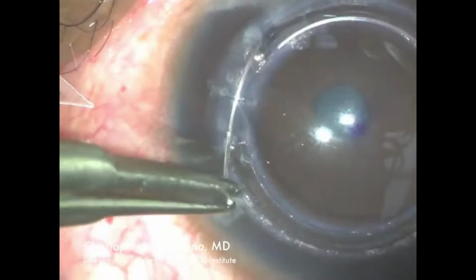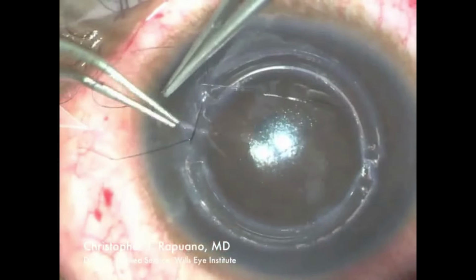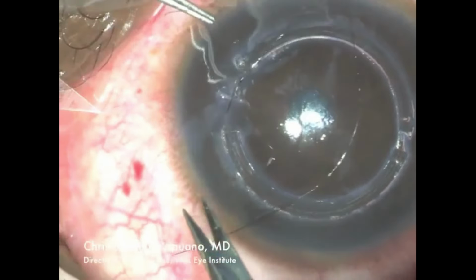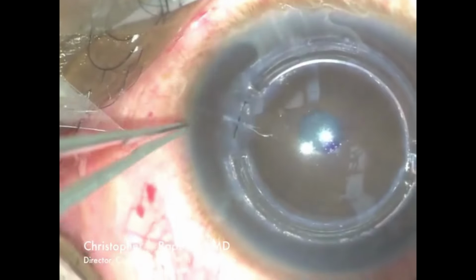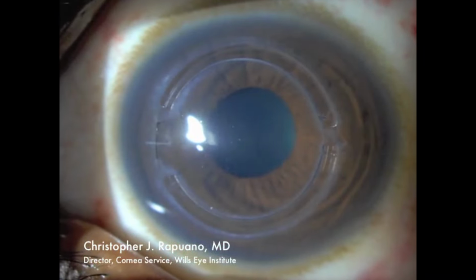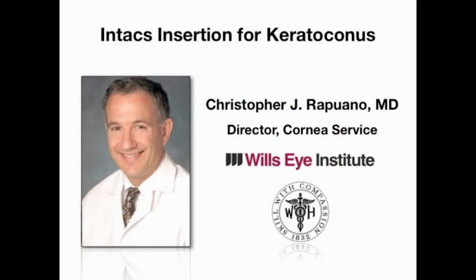Next, one suture is placed into the incision area to close that wound. It is tied, and then the knot is buried. I attempt to tie these knots fairly tightly so that the wound does not open up after surgery. These sutures are then usually removed about 6 weeks post-op. At the end of surgery, the Intacs look beautiful. Here is a post-operative day 1 photograph, nicely centered, well-placed implants.